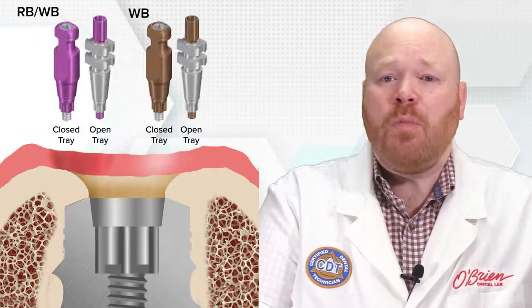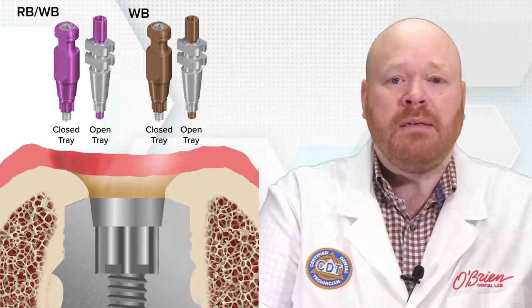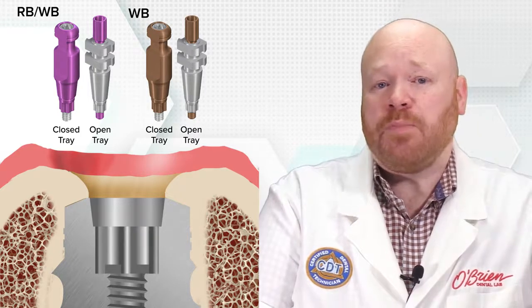And to complicate it even more, this wouldn't necessarily have been apparent when taking the impression because the RB and WB impression copings are exactly the same with the exact same narrow emergence profile. The only difference is that the RBWB impression coping is pink and the WB impression coping is brown.